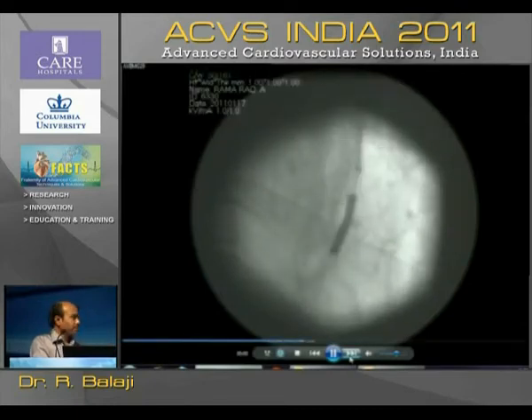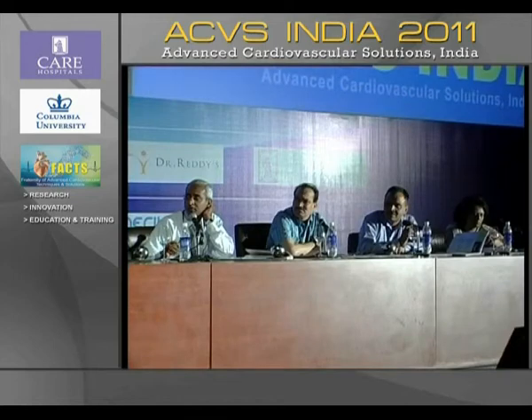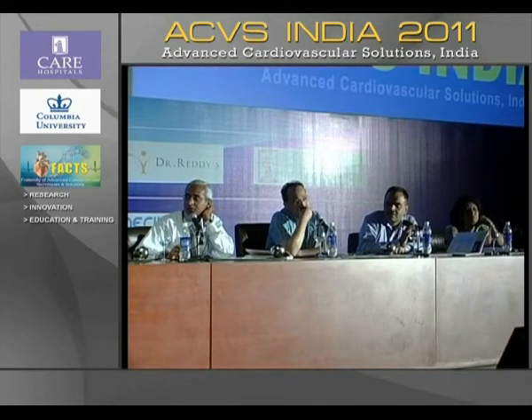Thank you very much. What was the atmosphere at which you deployed the covered stent? The covered stent was deployed at 7 atmospheres. The nominal was about 6 atmospheres. So why do you think there was a persistent leak after the covered stent was deployed? Probably the covered stent was not opposed to the wall, and probably there was still a gap there.